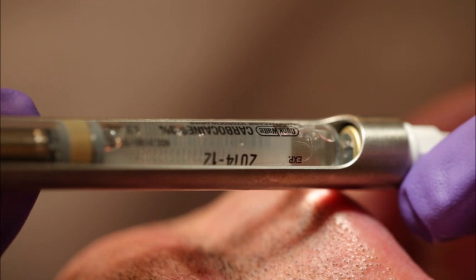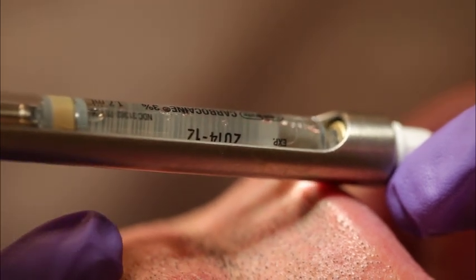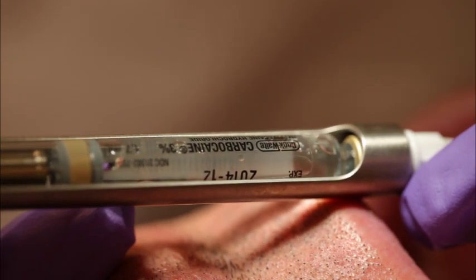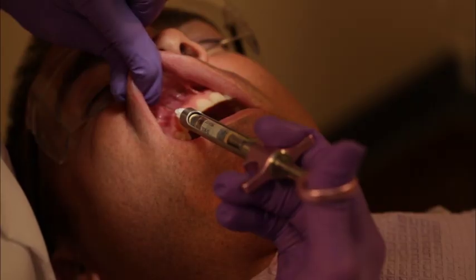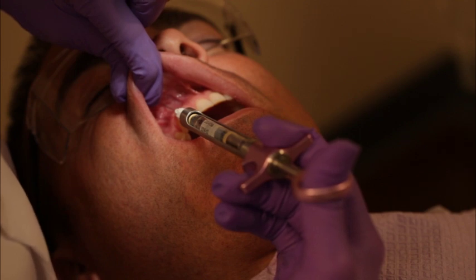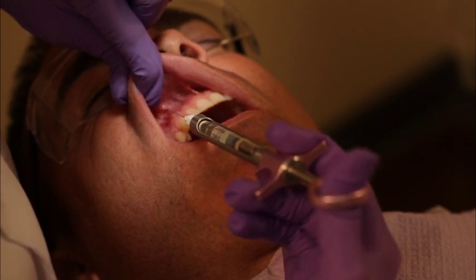Aspirate by pulling the thumb ring back gently on 1 to 2 millimeters at the injection site to prevent the possibility of an intravascular injection. If aspiration is negative, slowly deposit approximately 0.6 to 0.9 milliliters of solution, 1/3 to 1/2 of the cartridge, over approximately 30 to 60 seconds. If the tissue balloons, the deposition of solution is too rapid.